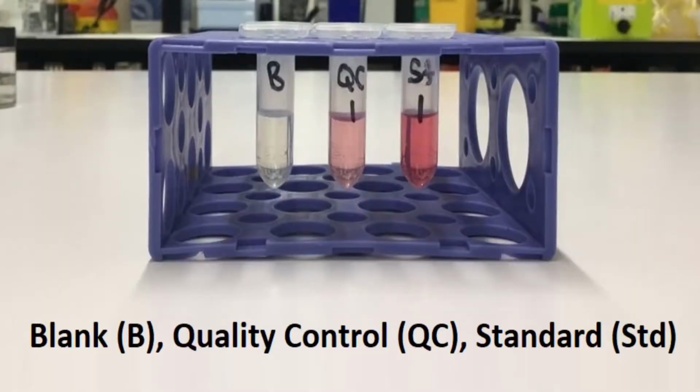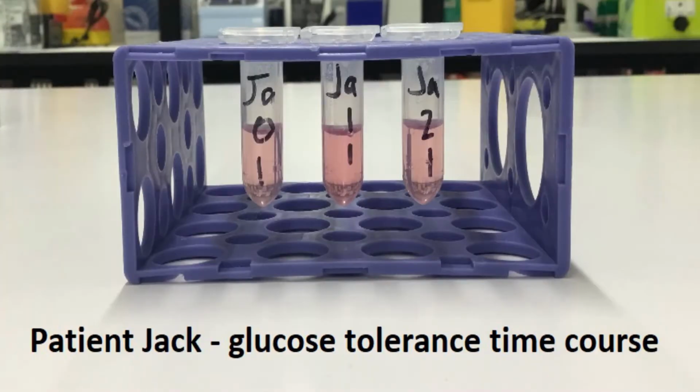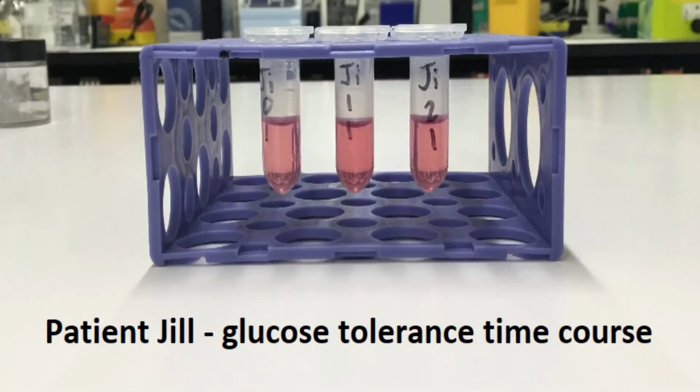Right, now guys, we're just going to give you a quick look at some pictures from an experiment that we've done. So you can see your blank sample is clear because it doesn't have any glucose in it. Your quality control sample is slightly pink, and your standard sample is a really nice pink color, so you know the concentration of glucose in that tube. Here we have the time course for Jack, and the time course for Jill.